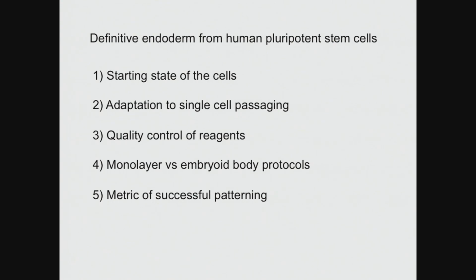Adaptation to single-cell passaging. This is kind of a somewhat vague area, but for a lot of these protocols there will be steps where the cells will have to be dissociated to a single-cell stage. And we know that pluripotent stem cells don't really like being by themselves. So it's very easy to kill these cells, and hopefully today, in both the morning and the evening session, you'll learn some very simple things that we've learned the hard way that promotes survival of cells as a single cell.